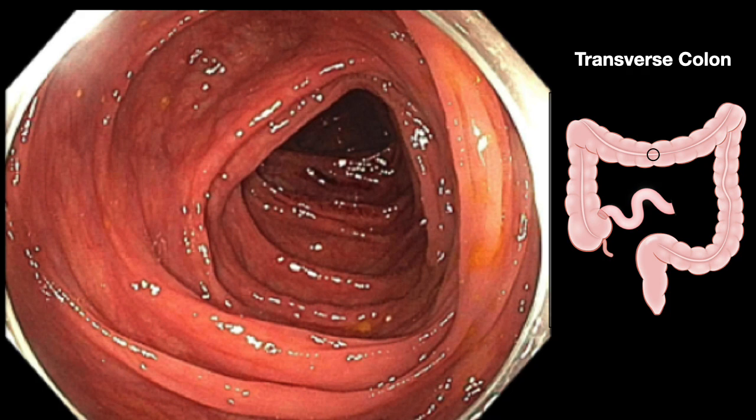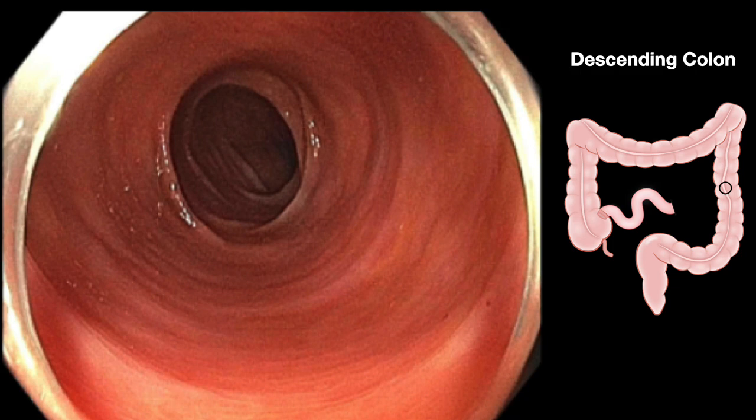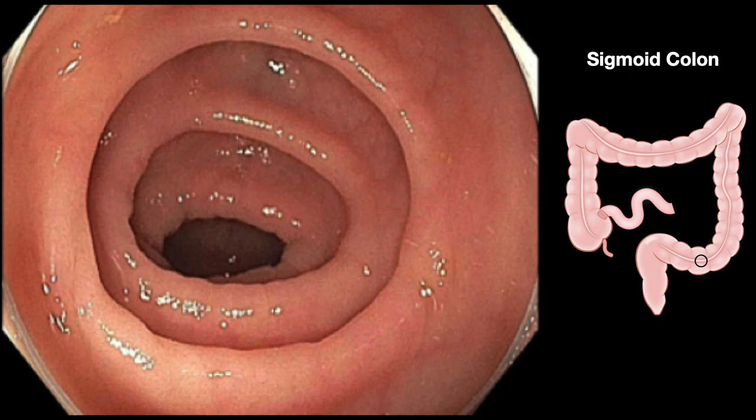And as you come to the left side, you see the shadow of the spleen. Sometimes that is the splenic flexure, as you can see here. With the patient lying on the left side for colonoscopy, as you come to the splenic flexure, you may see a puddle of fluid as well. So that is another way to figure out whether you've reached the splenic flexure. And then the descending colon, wide open. Sigmoid colon, where the folds are round and narrowly interspersed, not at much distance.